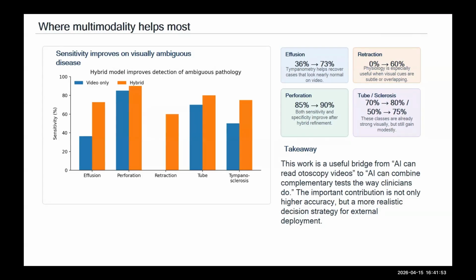All right. So moving on from the demography, did you do anything to calibrate the sensors or cameras that were used, or did you just receive the data as it was collected in a normal previous clinical encounter? Yeah, we didn't calibrate it. We collect all kinds of data. This is why, because in real clinic cases, doctors don't calibrate their cameras very frequently.